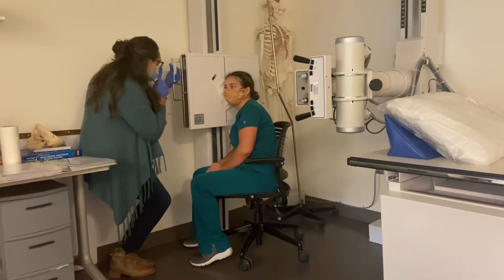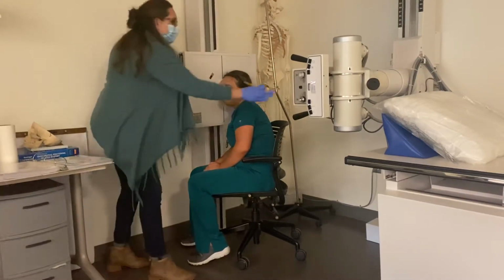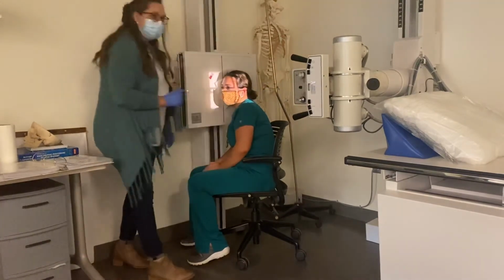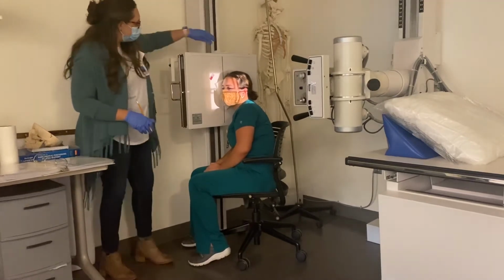Okay, go ahead and look at me again. Turn this way just a little. And then tilt the top of your head out just a little bit. Because that can change everything when you move them. So I'd have her hold her breath again, and then she can breathe and relax.